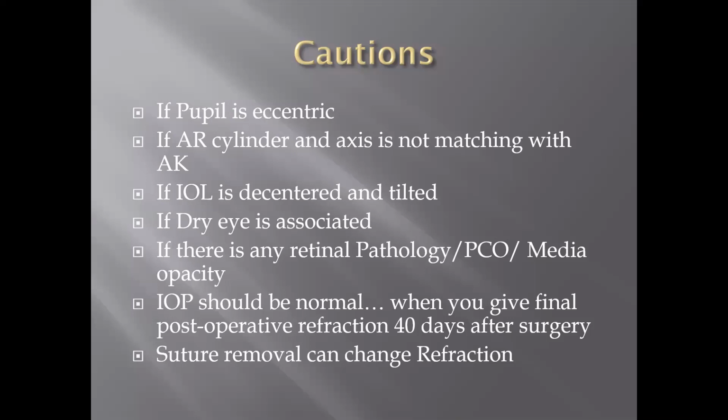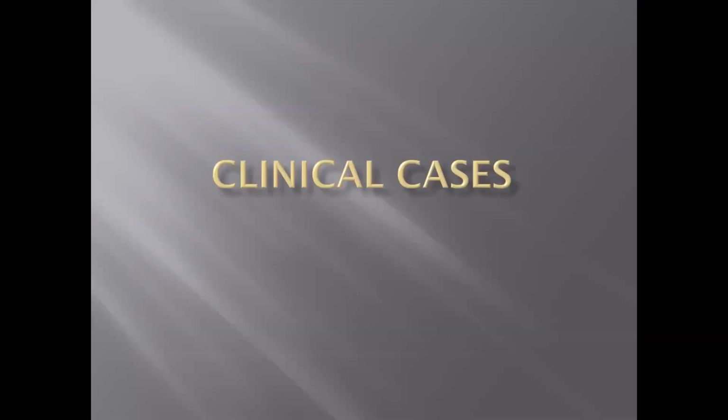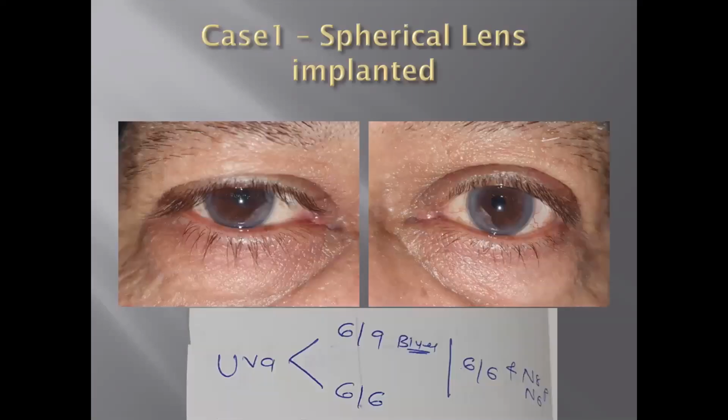You have to check the file of the ophthalmologist, the notes of the ophthalmologist. If the ophthalmologist has written everything nicely, whether there is some tilt or some decentration or pupillary decentration, it is there or not, and that will decide the final outcome of the subjective testing and the final best corrected visual acuity. So let's jump to certain clinical cases which will give you an idea of the existing clinical situation and what refraction you achieve.